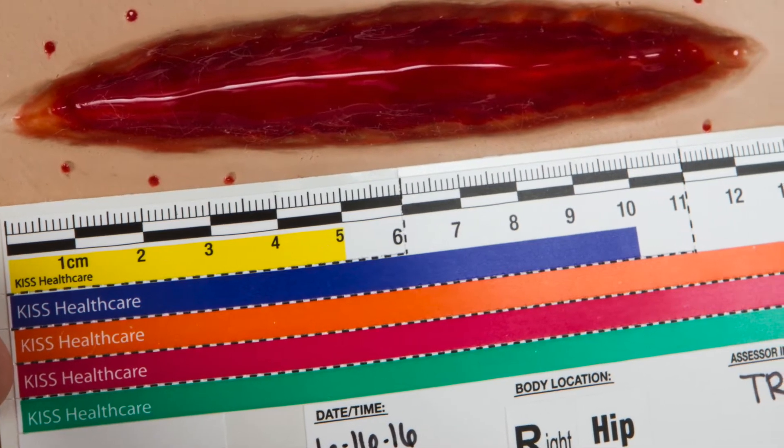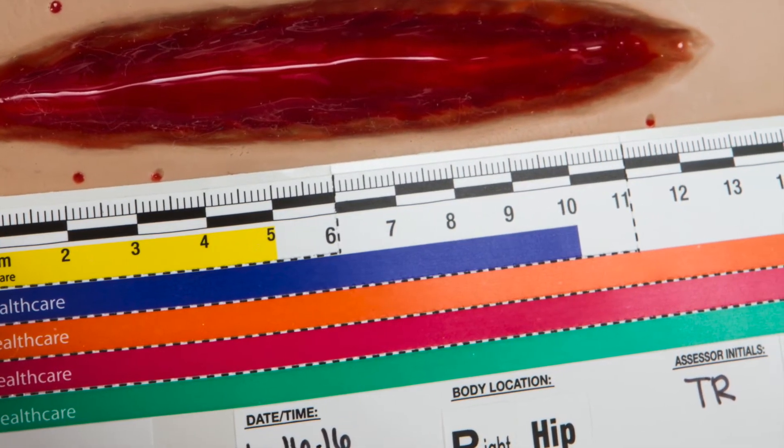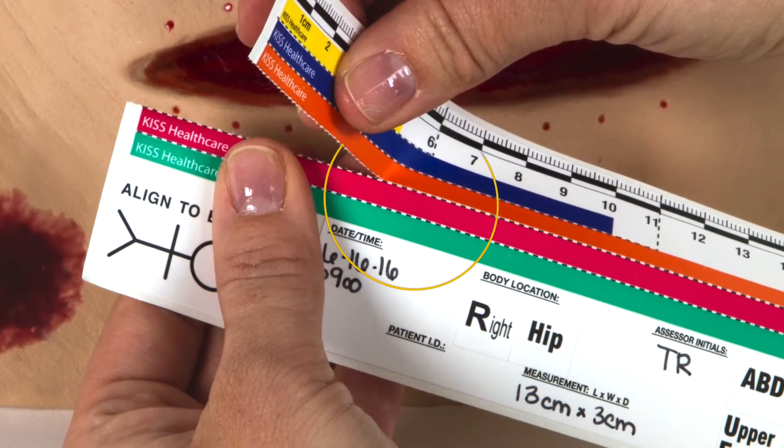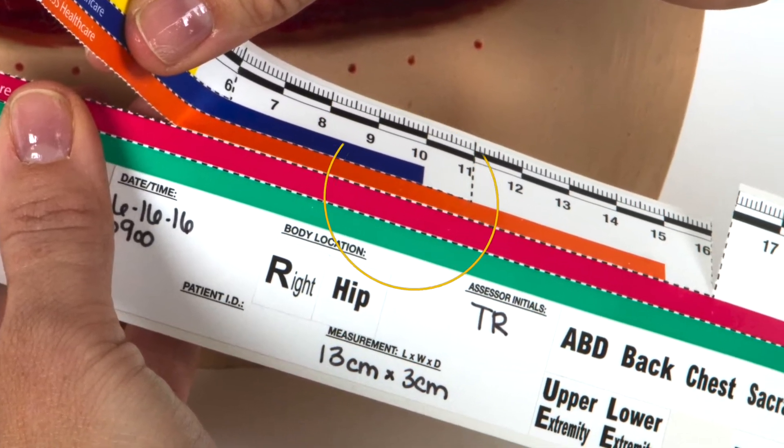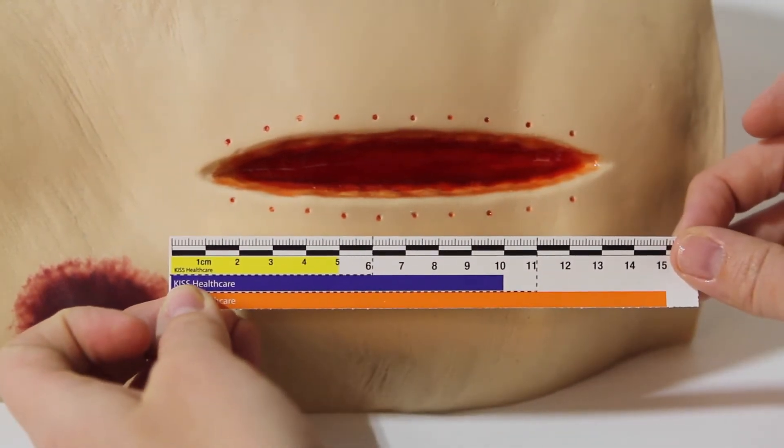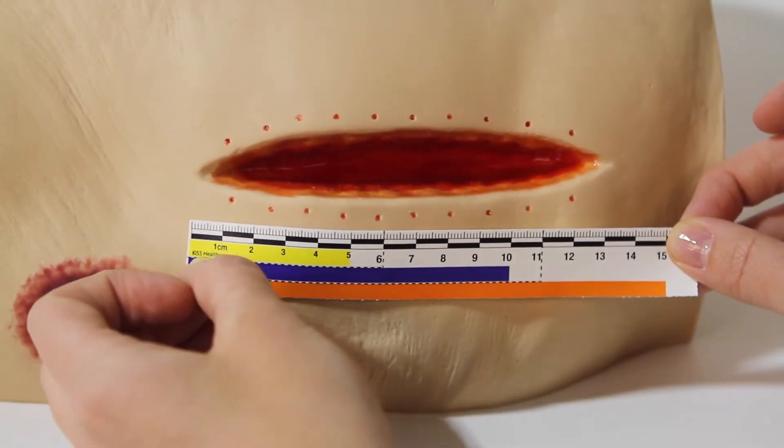Tear the desired length along the perforated lines. Next, tear down the length of the ruler, removing all the smaller bars. Remove the ruler from the backing and apply the ruler next to the wound. Be sure to leave enough healthy skin between the wound and the ruler.